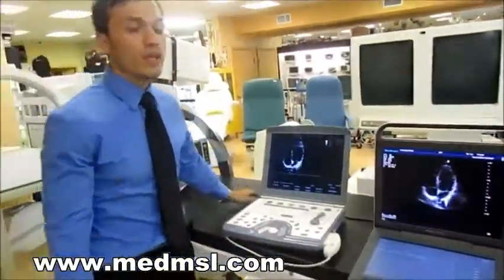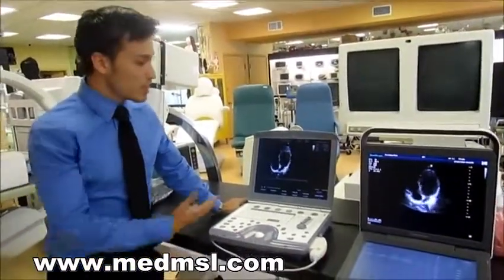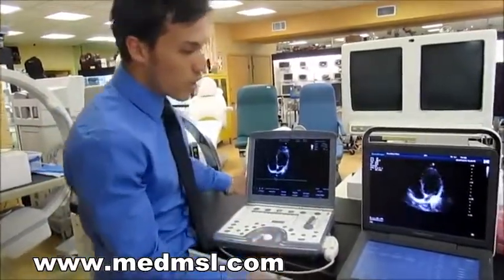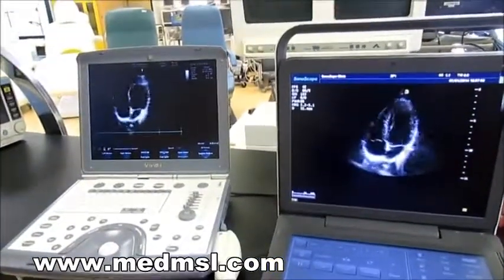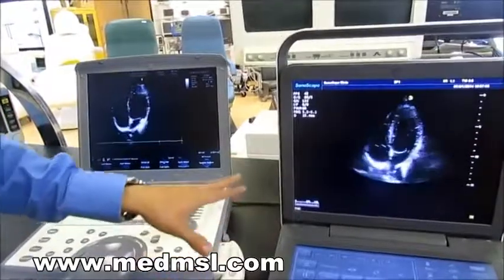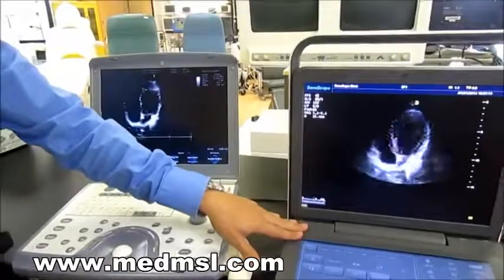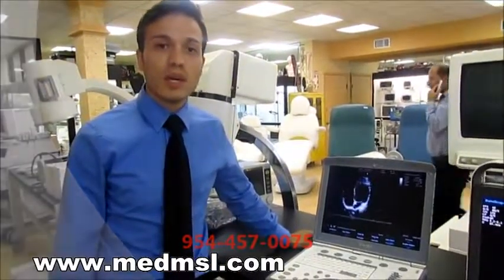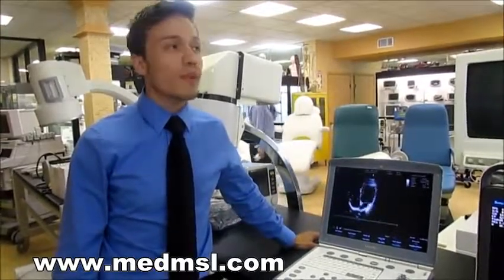We recommend the S9 over the Vivid system, and the decision is pretty clear from comparing the image quality. This is an amazing instrument, and it comes with a two-year warranty and a one-year warranty on the probes. If you have any questions, feel free to call us at 954-457-0075, or come by our showroom at 2512 Southwest 30th Avenue, Hallandale Beach, Florida — right off I-95.